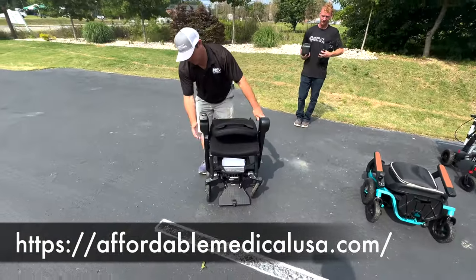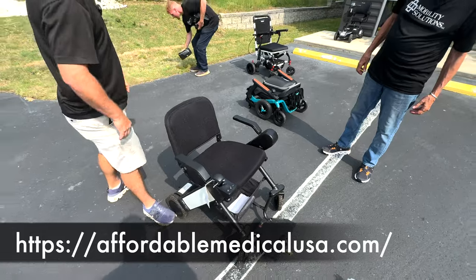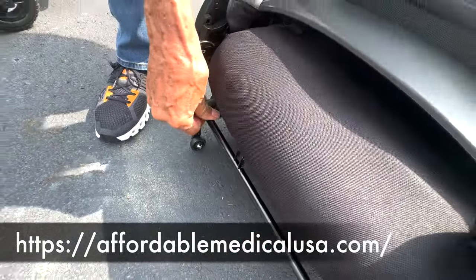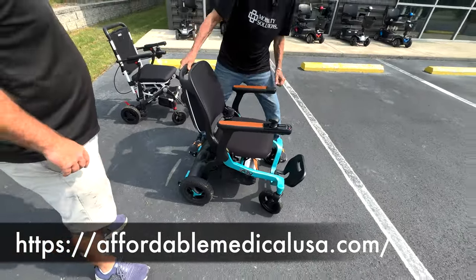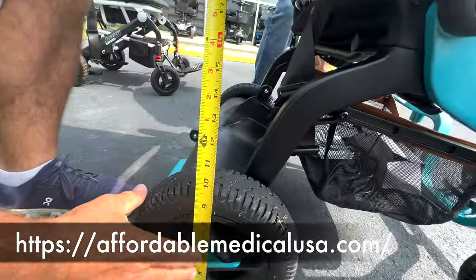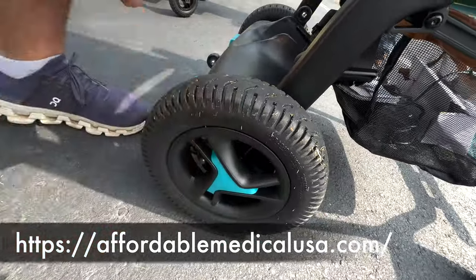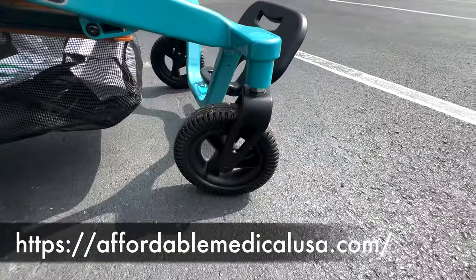This is how you unfold this one. Foot on that back plate, and you're going to push that button. This one, unfold it. Remember how to do that? Yeah. You push this guy down. Yep. Push down, and then lift straight up. All right. So let's check out these tires while we're here. About 9.5 inches. Pretty nice size tires. Air for a smoother ride. Front tires are thicker, and the height of it.